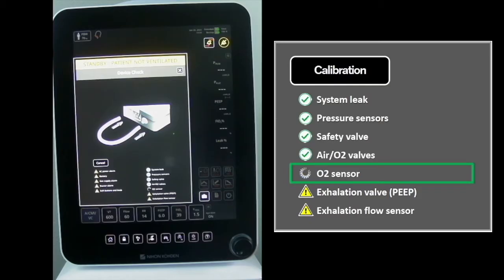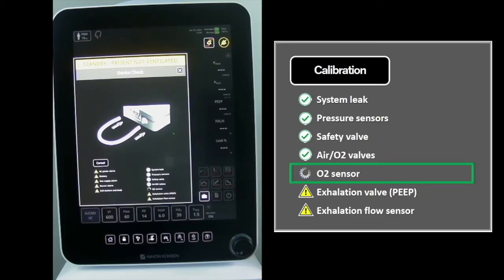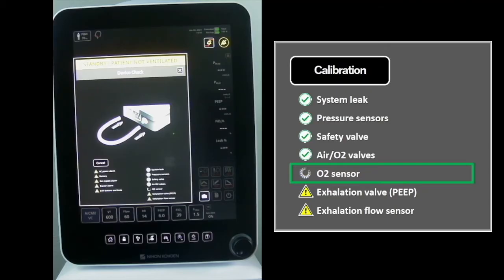The O2 Sensor Test calibrates the oxygen sensor. This is a two-point calibration at 21% and 100%. In the video, mine is going to fail due to no O2 source.